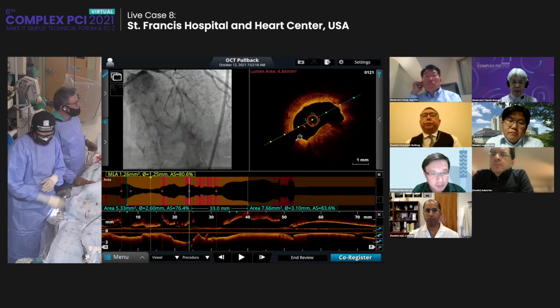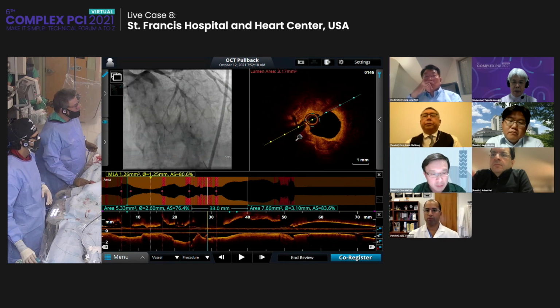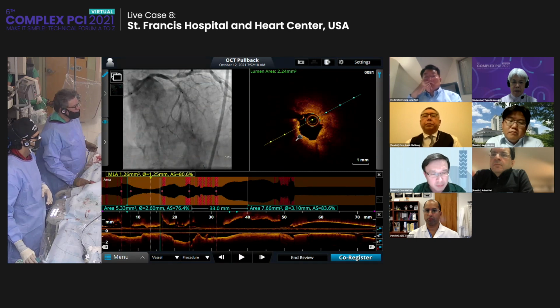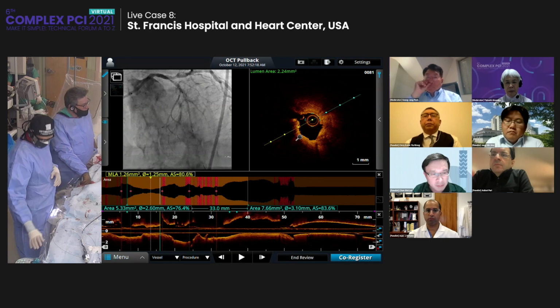Could you scroll somewhere else where we could show an area of calcium that's not fractured? Here we do have some fracture. There is fracture here in this calcium, but it's almost circumferential. There was one area I think that was not here, right here. So right there, it's basically almost 270 degree calcium. We can measure the depth of the calcium and the length.